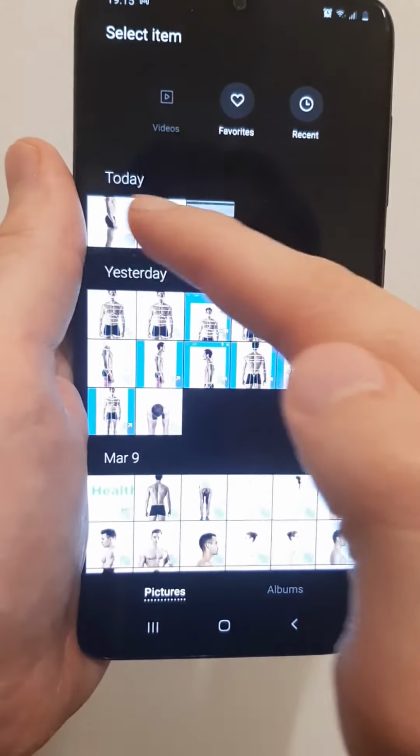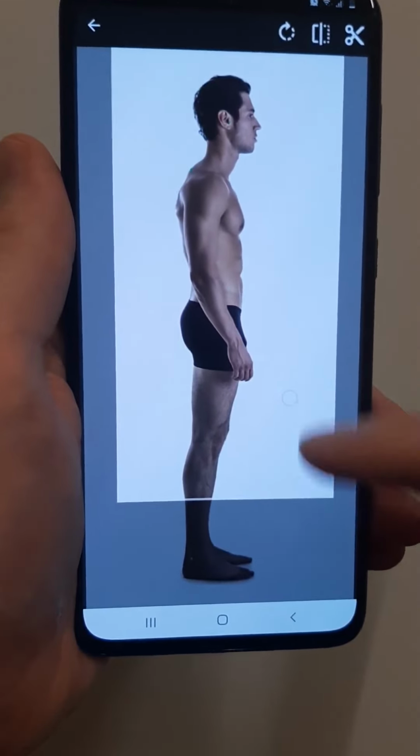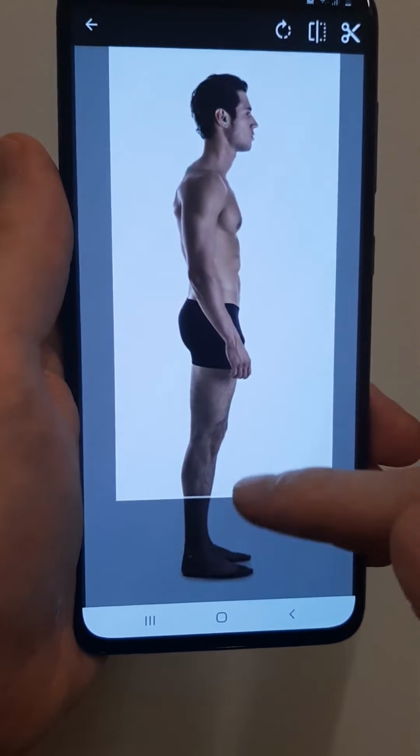Again, here we'll be going with markers already preset on the body. Switch, marker detection. As you can see, APECS recognized it. We just verify. And let's hide person's body and put it in black and white. And let's validate.